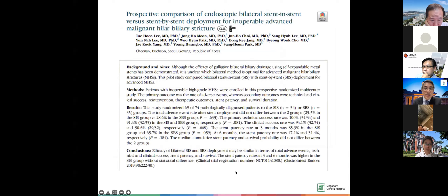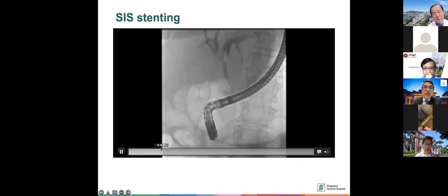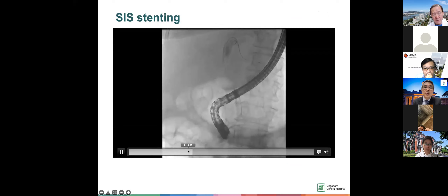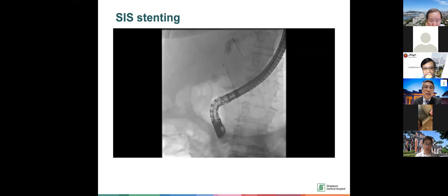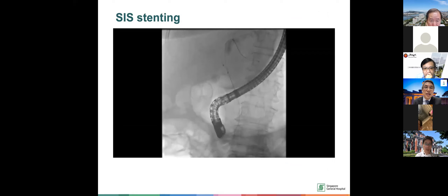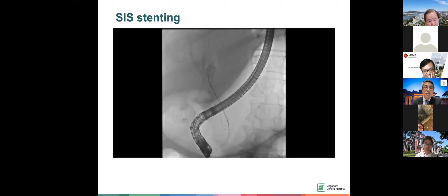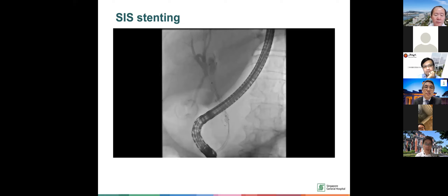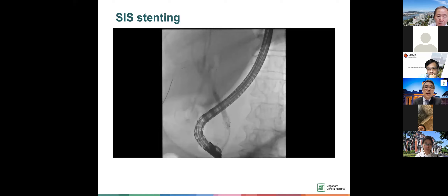Here's an example of a stent-in-stent procedure. We removed the old plastic stent, then got a wire to the left side and balloon dilated. Once we put in the wire to the other side, finding the right side is the hard part — the first pass went to the cystic duct. We finally found the right side and put two wires — one on the left, one on the right. We stent the left first because it forms a nice bend that opens up the struts to allow passage to the right side.